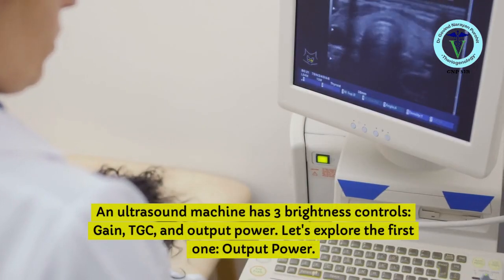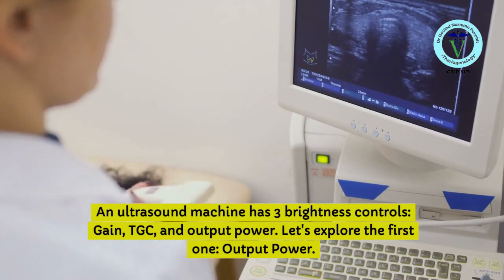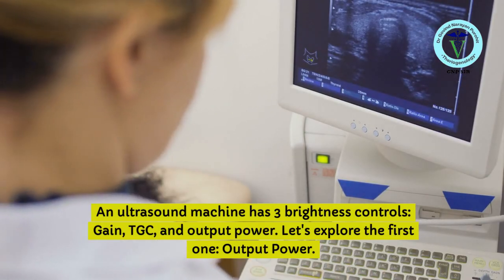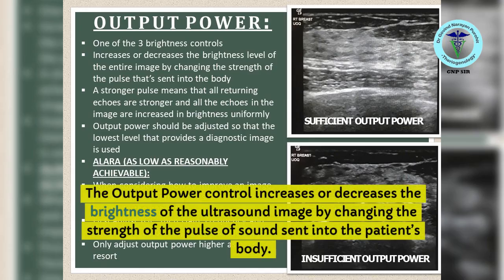An ultrasound machine has three brightness controls: gain, TGC, and output power. Let's explore the first one, output power. The output power control increases or decreases the brightness of the ultrasound image by changing the strength of the pulse of sound sent into the patient's body.